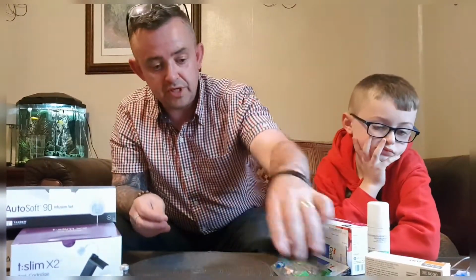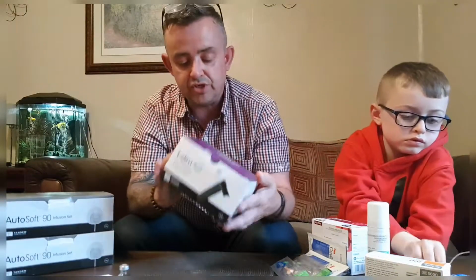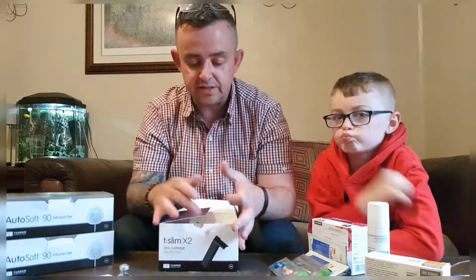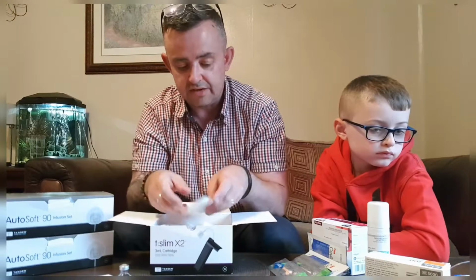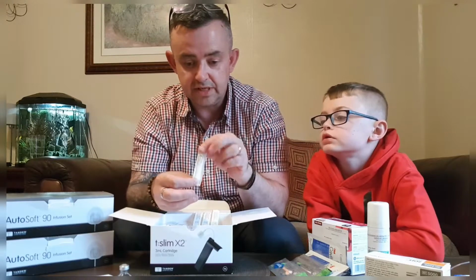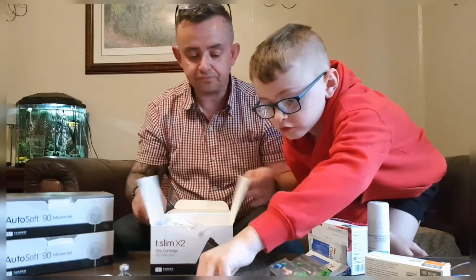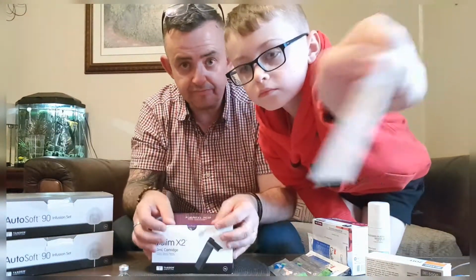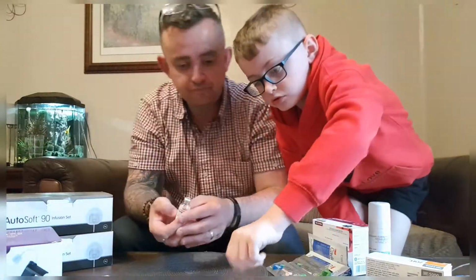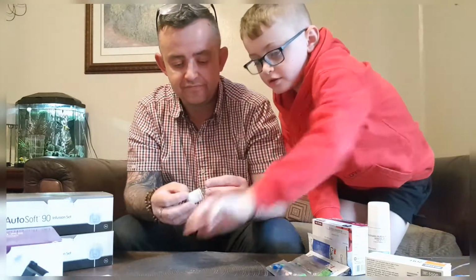Absolutely. So we'll put the pump to one side at the moment, and then what we need is this box here, which you get from your team. Here in the UK, we have to go and collect these, and they show us what's in it and how to use it. So we need a new cartridge. We need a needle, and we need a syringe. And this syringe. And a cartridge.